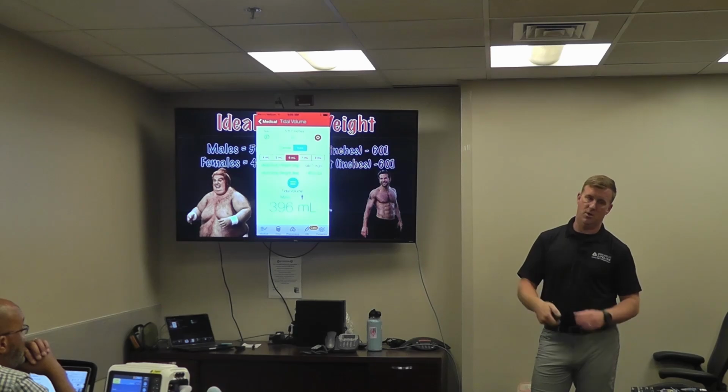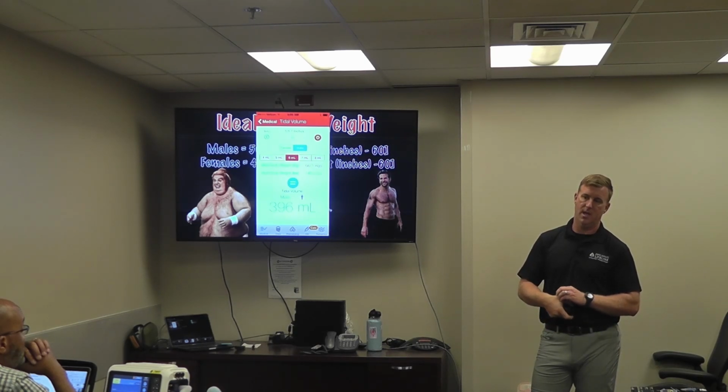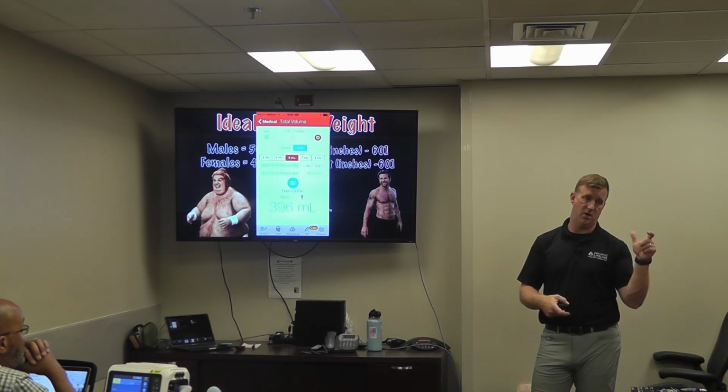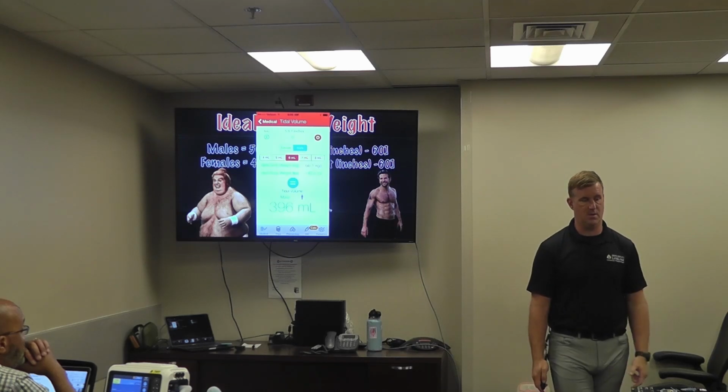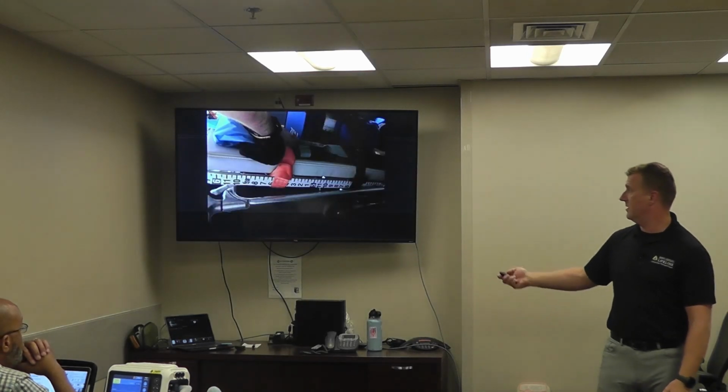Interesting, it will also, if none of you guys have ever been told this about the T1, as you change that, you'll notice your tidal volume will change if you're in SCMV. That's 8 cc's per kilo. Okay, it actually changes the defaults at 8 cc's per kilo, which we'll talk about here in a second.